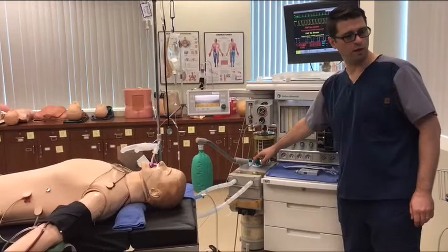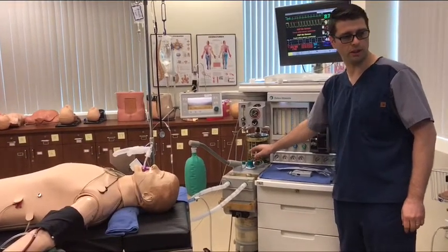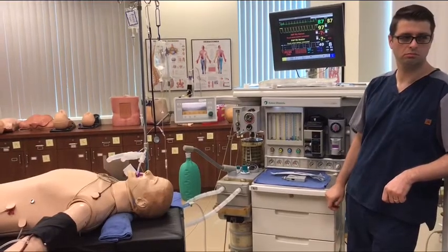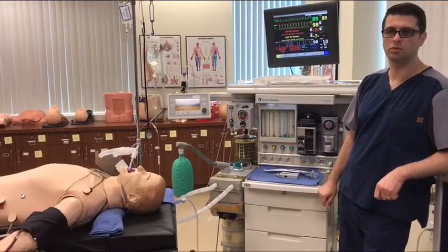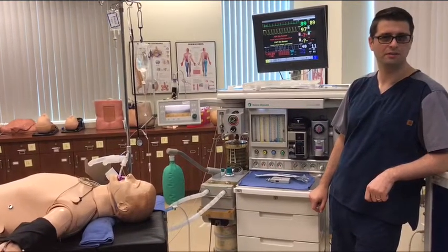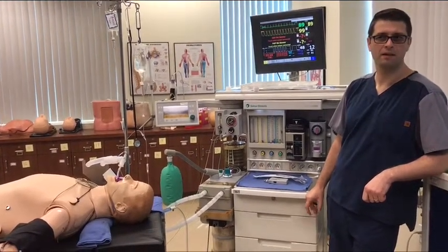Do you use the APL on this one yet, or just leave it? Do you guys use the APL? You know this. Only if you get it back in. You guys know this. So the answer is no. Why is it no? Because you have to breathe against it right now.